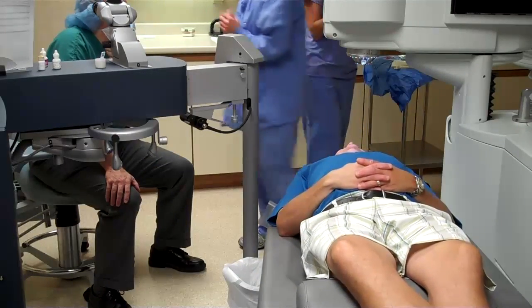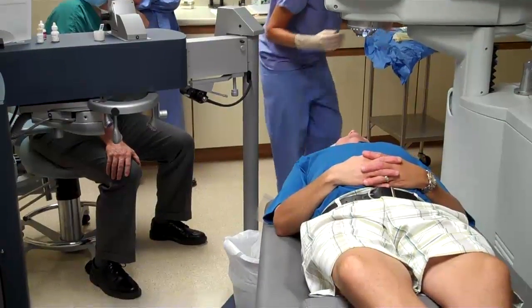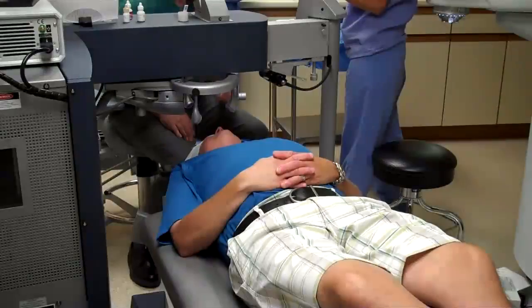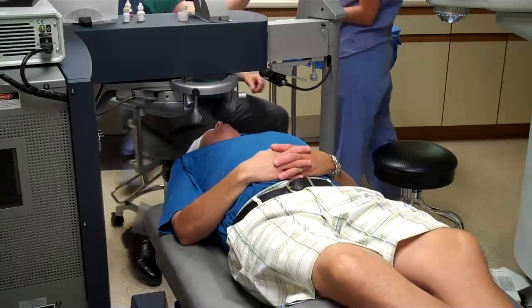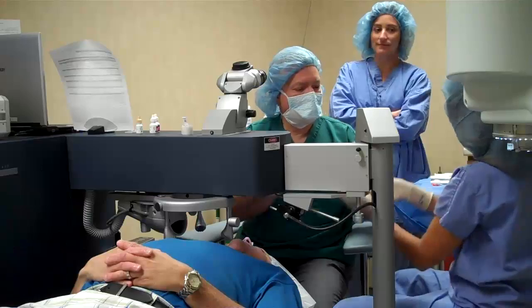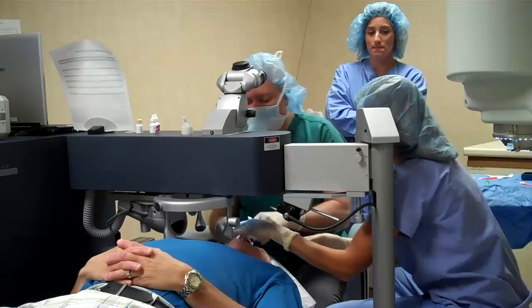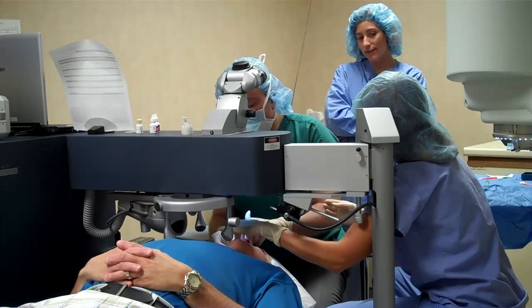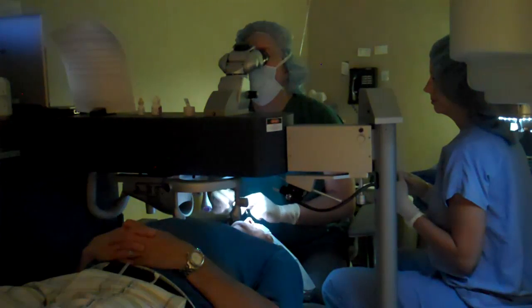Once this procedure is performed, as you can see, the bed will rotate into position, now under the actual treatment laser. At this point, the patient's ready for the treatment. Some preparation of the eye is performed. We use betadine to clean around the eye, and then some drapes are placed. The right eye is always performed first.